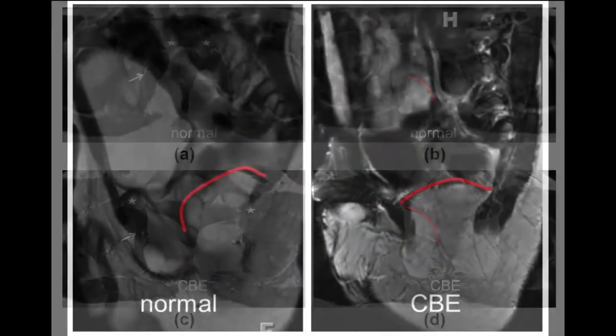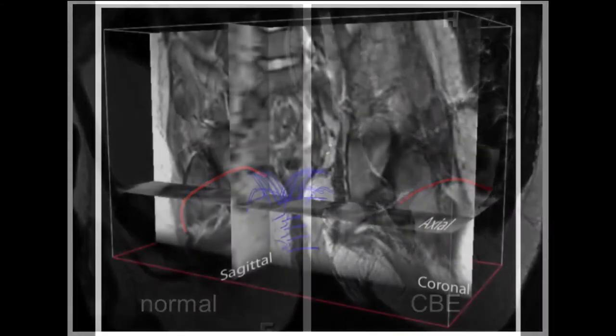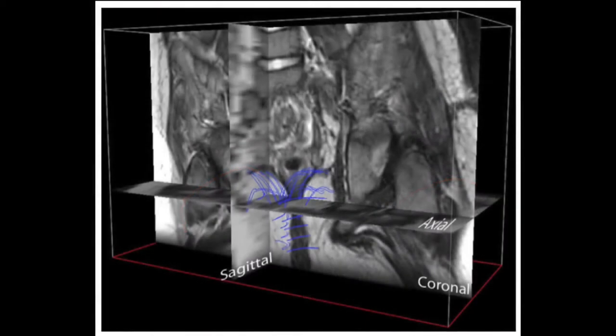Puborectalis. Here we see a 3D reconstruction of the pelvic floor anatomy in a bladder extrophy patient.